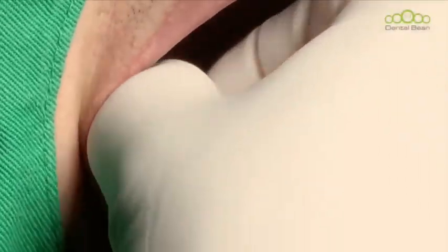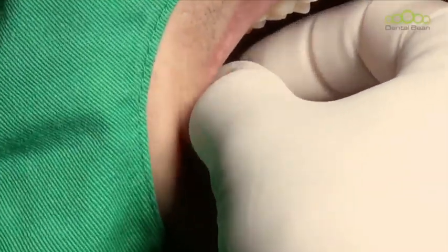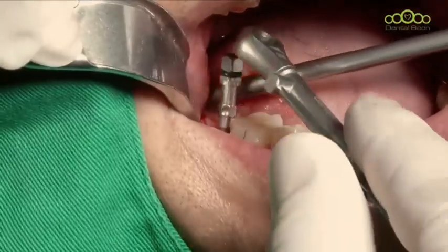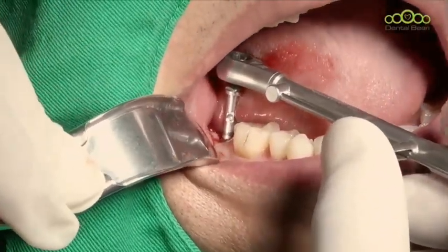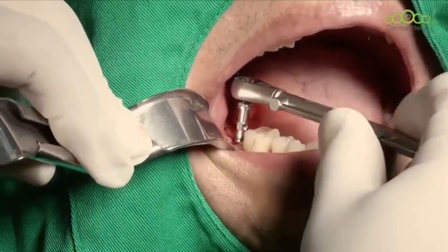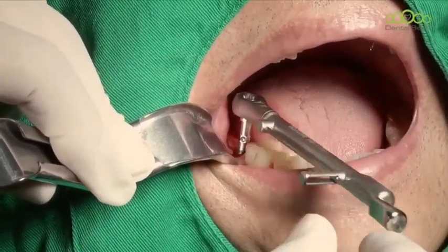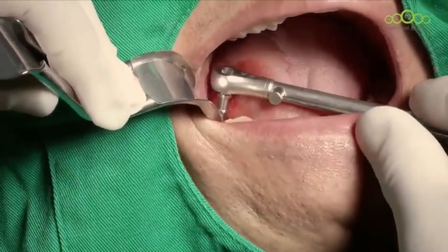Okay, control depth and angulation of the implant carefully. Minimum 4 millimeter deep from the gingival margin. Every implant company supplies the tool to notice the depth of the implant.